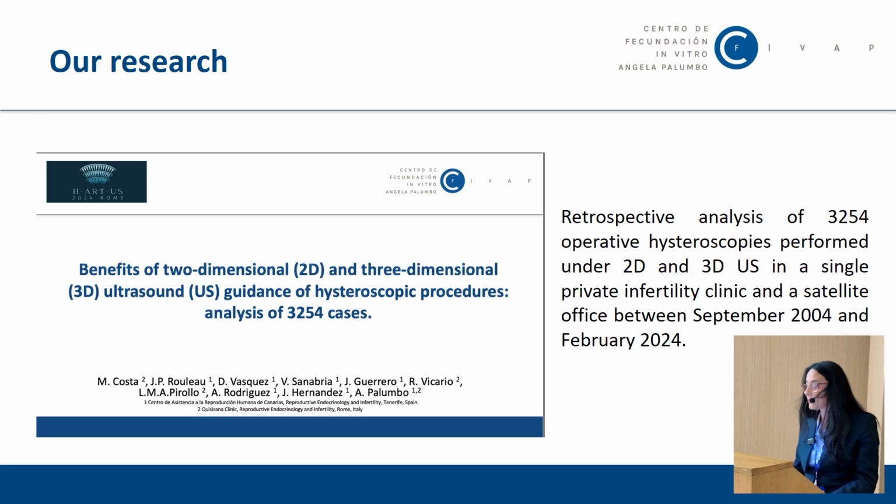This is the last abstract that we presented to the ESHRE Congress in 2024. This is a retrospective analysis of more than 3,000 operative hysteroscopies performed under 2D and 3D ultrasound.